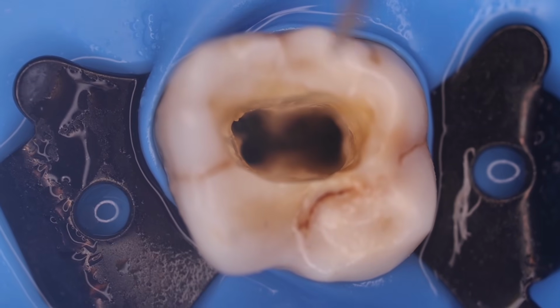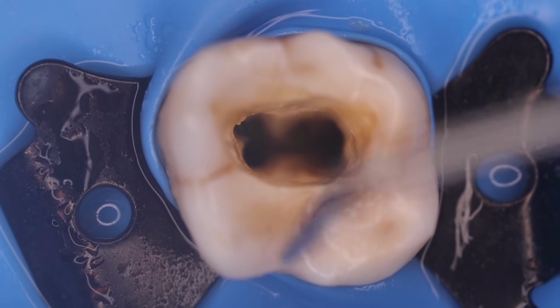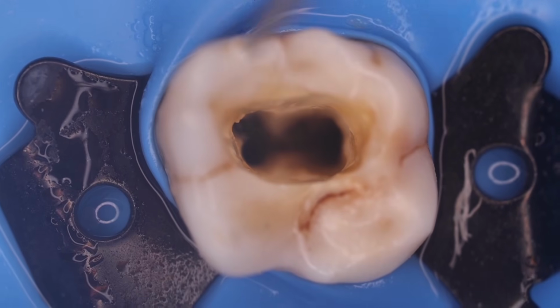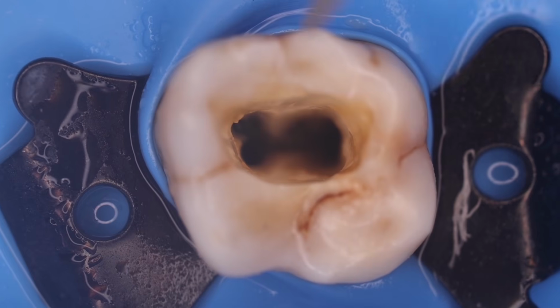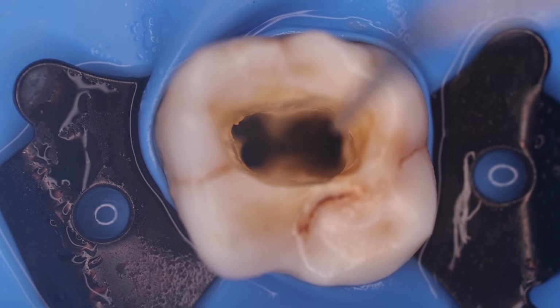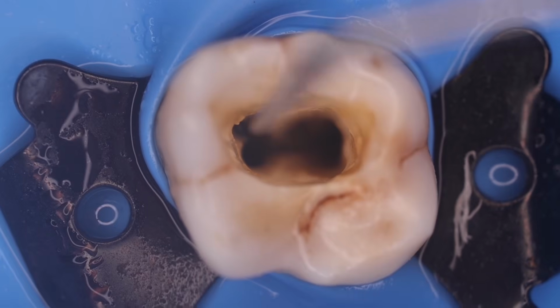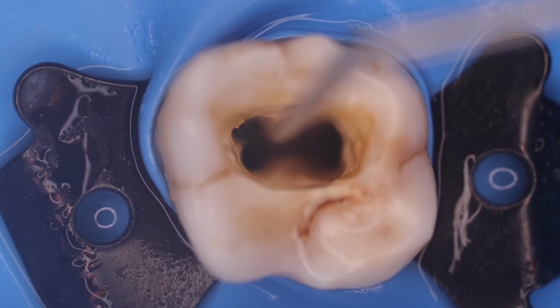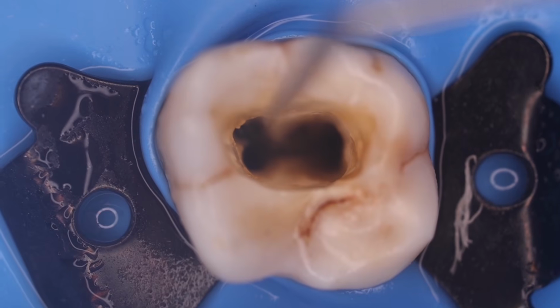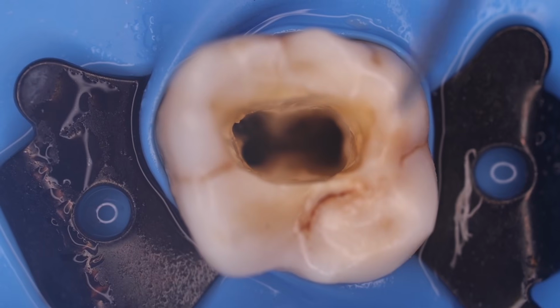So this was all about the access cavity preparation for the maxillary first molar with the canal orifices, and we will be proceeding with the working length with the electronic apex locator in the next session for this particular tooth. We will also be preparing these canals with the help of the WaveOne Gold file, a reciprocating file system from Dentsply, and we'll meet in the next session. Till then, goodbye, take care.